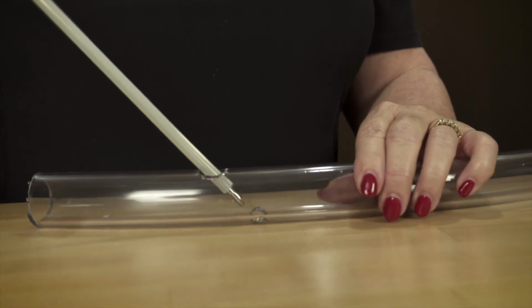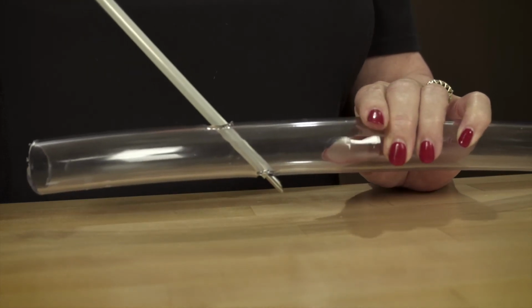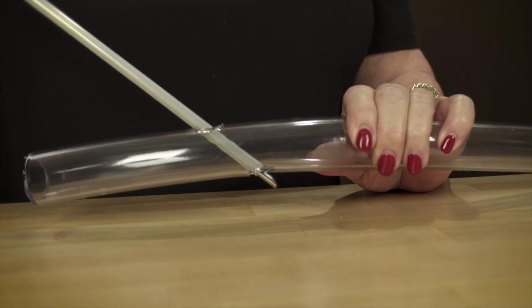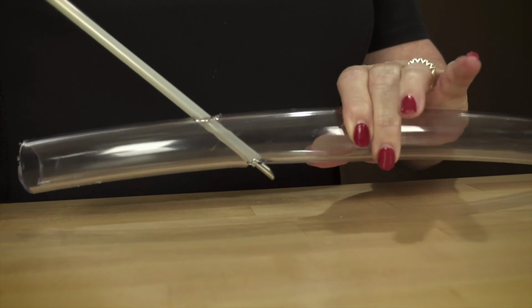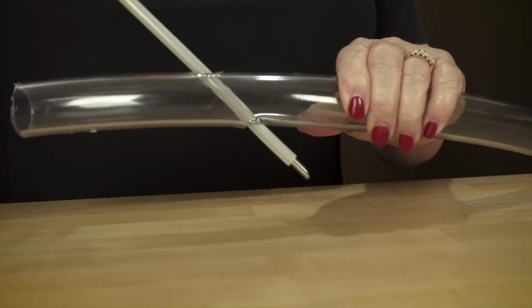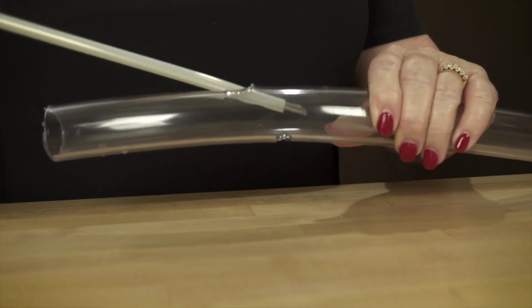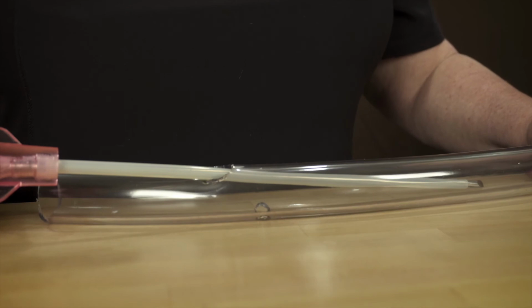Advance the stylet through to the small hole on the back wall of the vein to show how easy it is to advance too far. Again, there might be a strong flash of blood, but the cannula tip has passed the lumen of the vein, and therapy could be delivered partially in, partially below the vein, or completely below the vein. Even if this insertion is salvaged with the cannula advanced into the vein, this injured site can be leaky and cause failure of the peripheral IV site.